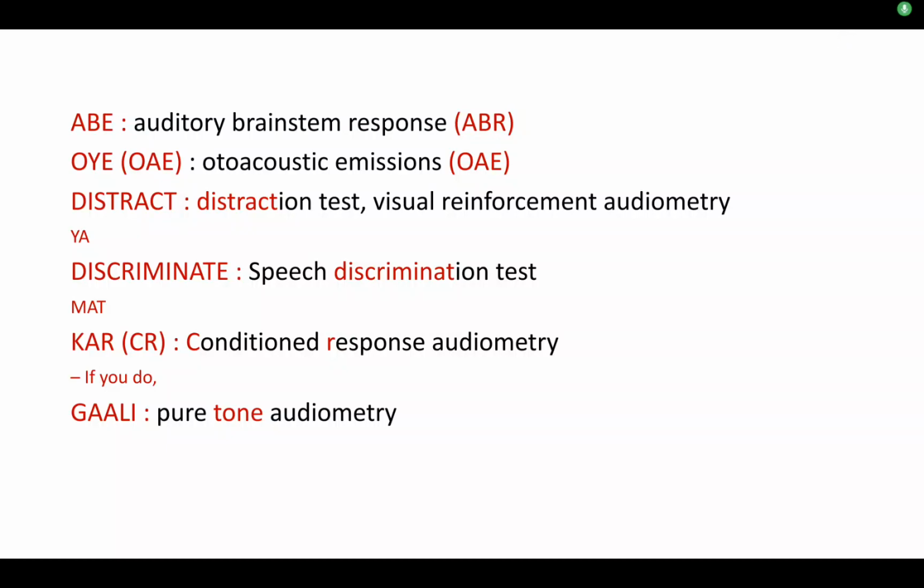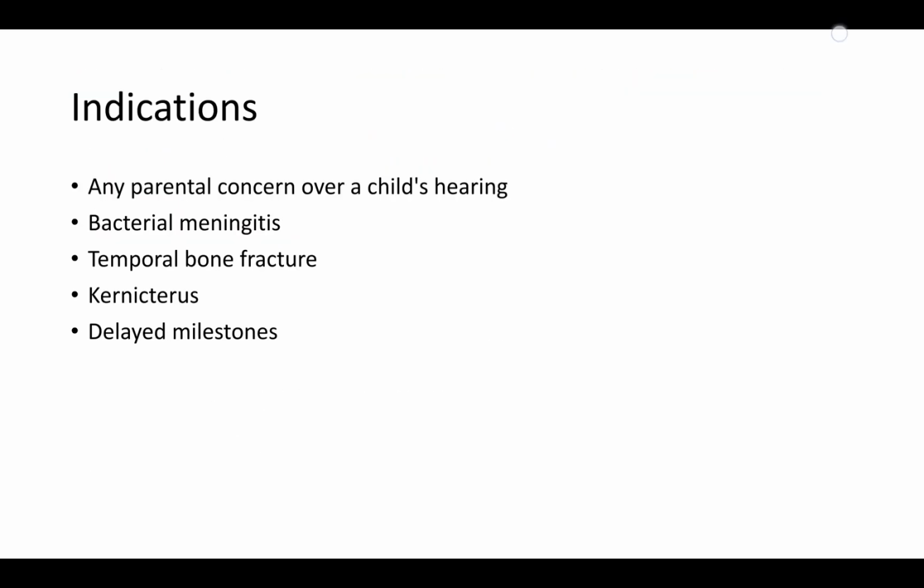Hi guys. So in this video we'll be talking about different kinds of hearing tests done in children. Which hearing test you have to choose depends on the age of the child. So what are the indications of hearing tests first of all?